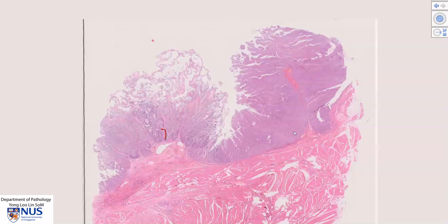Papillary urothelial carcinomas can recur, and hence these patients require long-term follow-up. If the tumors are high grade, as in this case, they also have a risk of progression to invasive urothelial carcinoma, which has a worse long-term prognosis.